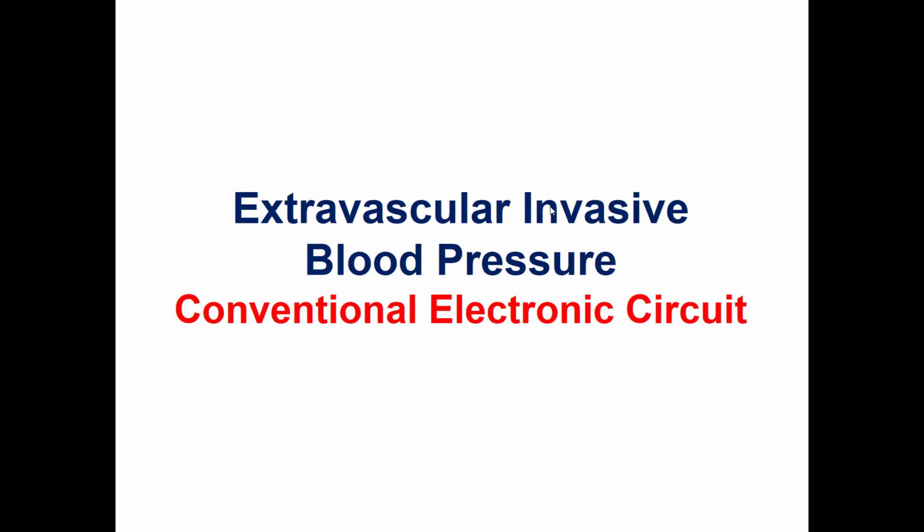So, till now, we have covered the extravascular invasive blood pressure. We used the prerequisites of signal processing and modeling. Signal processing was used to understand the periodic nature of the arterial blood pressure waveform, and the modeling is used to understand the impact of the catheter and the line on the transmission of the signal, without distortion of the blood pressure waveform.